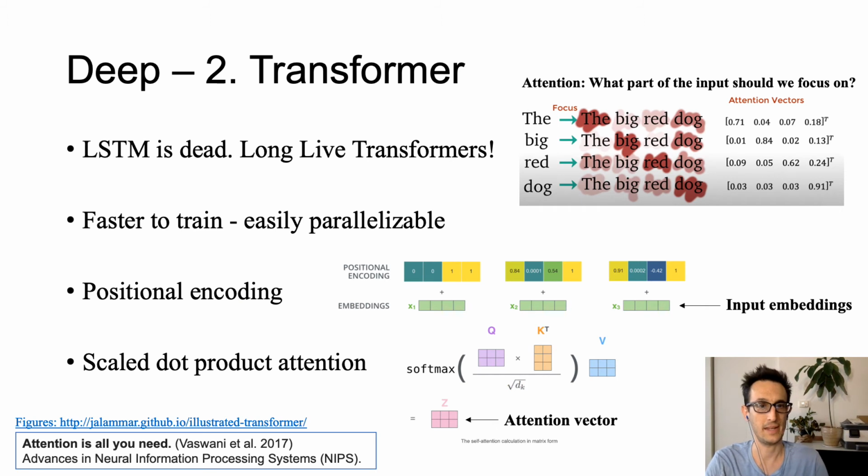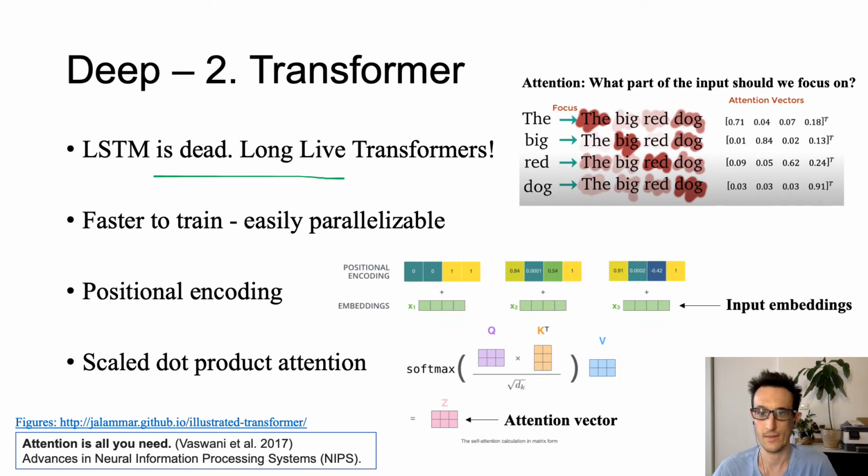So then we take the embedding that was learned and we pass it to a transformer neural network architecture. Transformers have become very popular recently. I'm sure people are familiar with them. They've had tremendous success in natural language processing, and nowadays are also being applied to computer vision tasks such as object detection as well as image classification. And particularly with regard to sequence type tasks, they have a lot of benefits. They can be faster to train compared to recurrent neural networks, and this is because we no longer need to do things in sequence. Instead, things can be parallelized out.